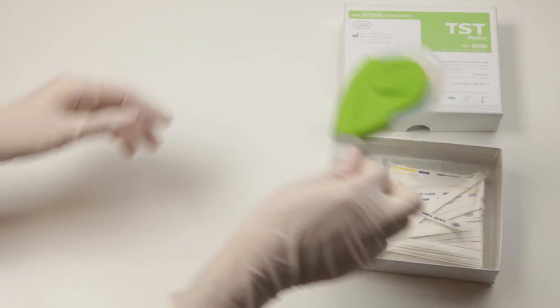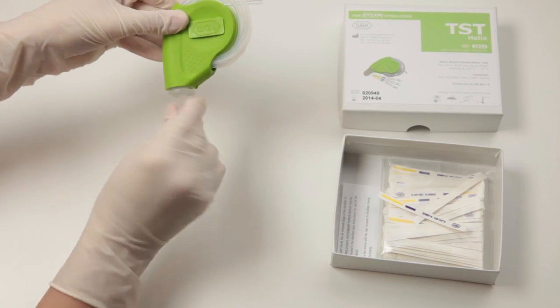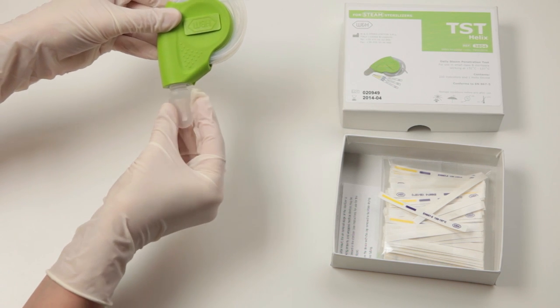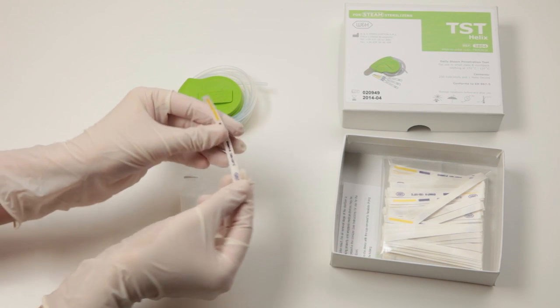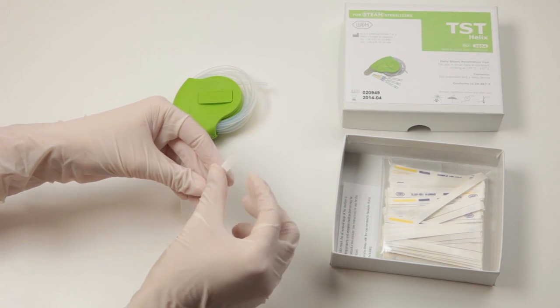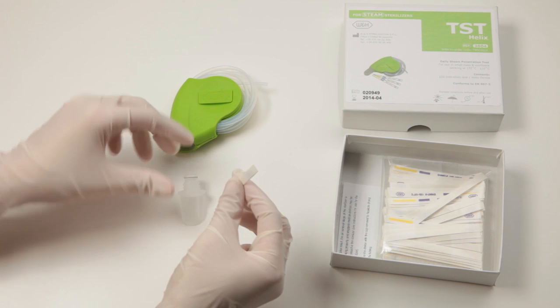Remove the cap of the Helix test device. Fold the Helix indicator test strip so that the chemical indicator is facing inwards. Push the folded indicator test strip into the cap and assemble the test device.